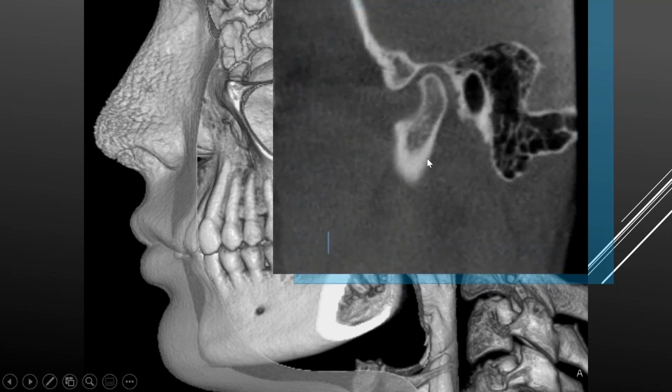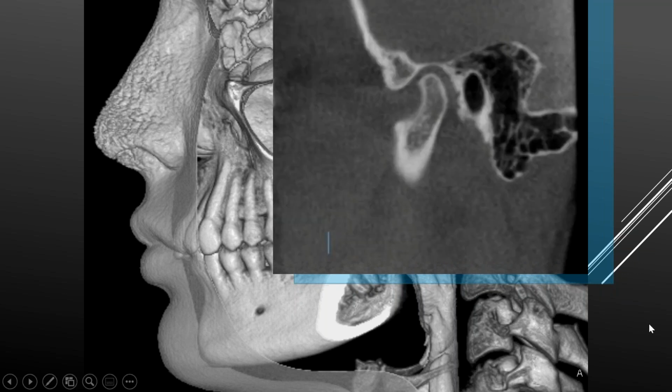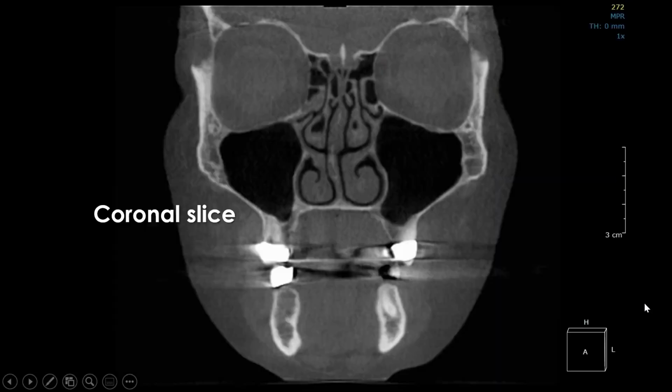So I superimposed a thin slice sagittal reconstructed view of the condylar head. And in there, condylar head, articular eminence, external auditory canal, and the mastoid air cells again. In 3D, you can actually see what's going on. So in the 3D rendering, we see a small osteophyte. Actually, this is called lipping, and it'll be occurring probably along the length of the condylar head in there. So you have ways of looking at this data: thin slice, color surface renderings, and moving your volume around so that you can see everything. But of course, that means you have to know a lot of your anatomy, and most of you are relearning it on the fly.